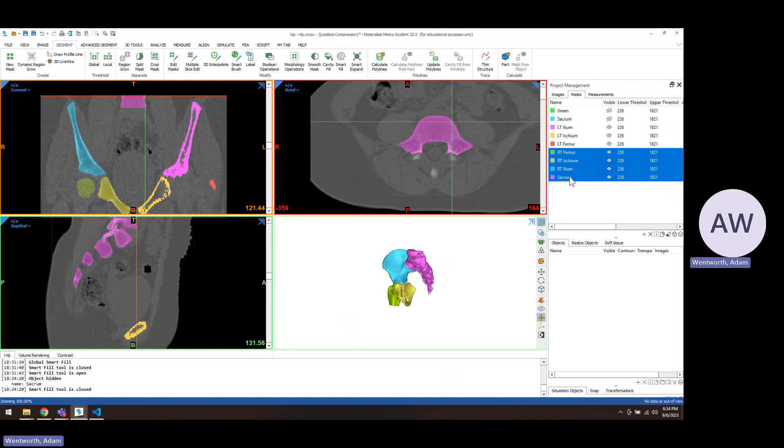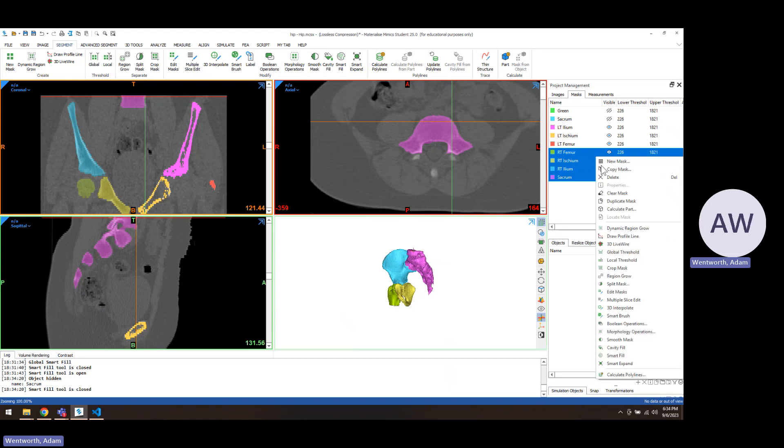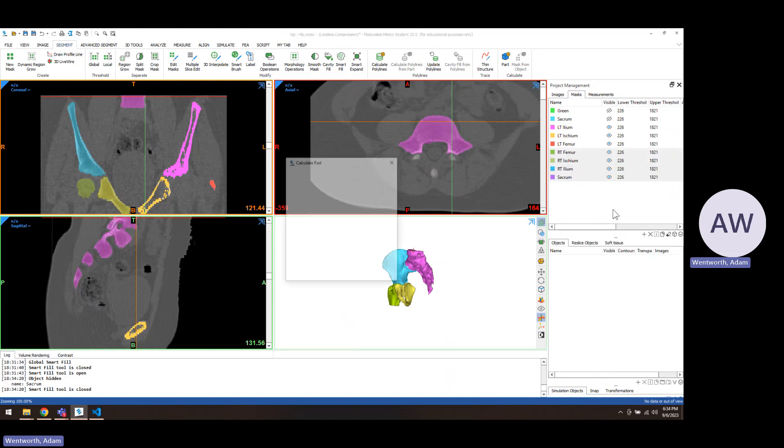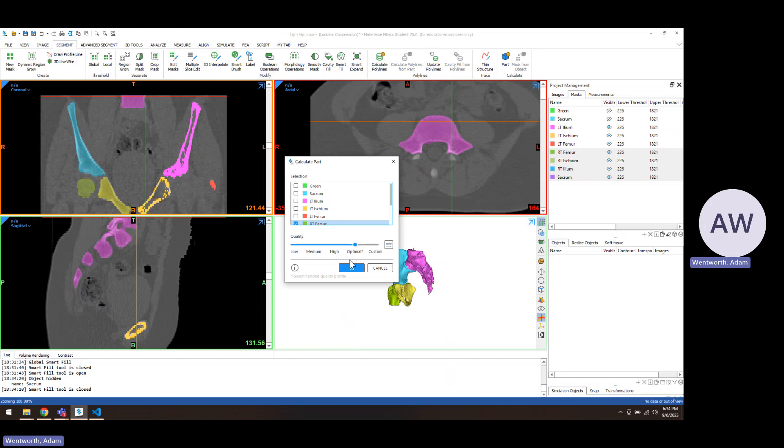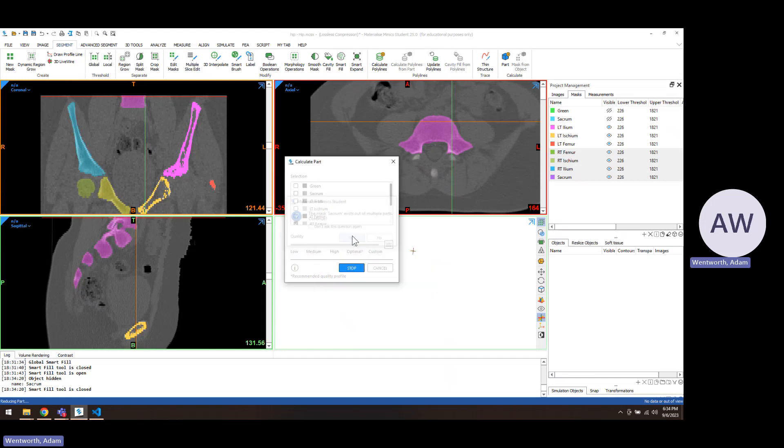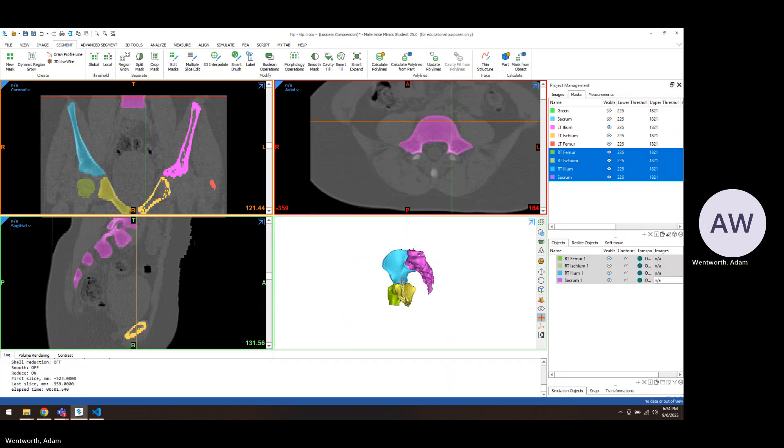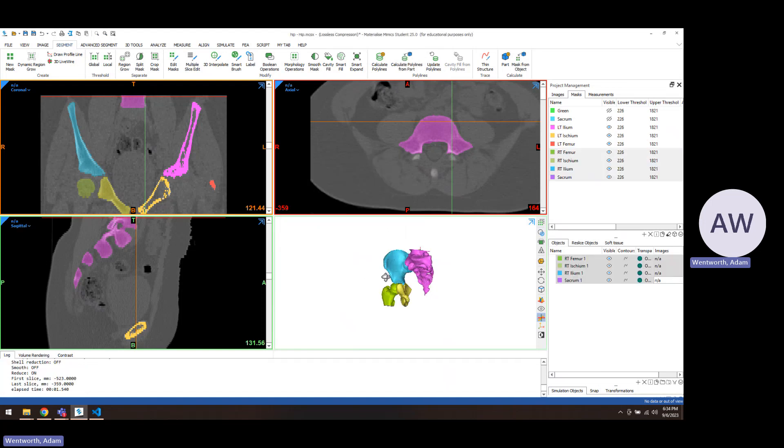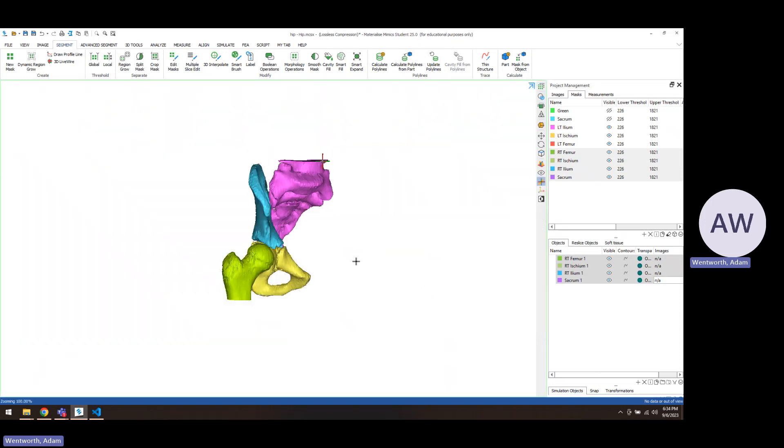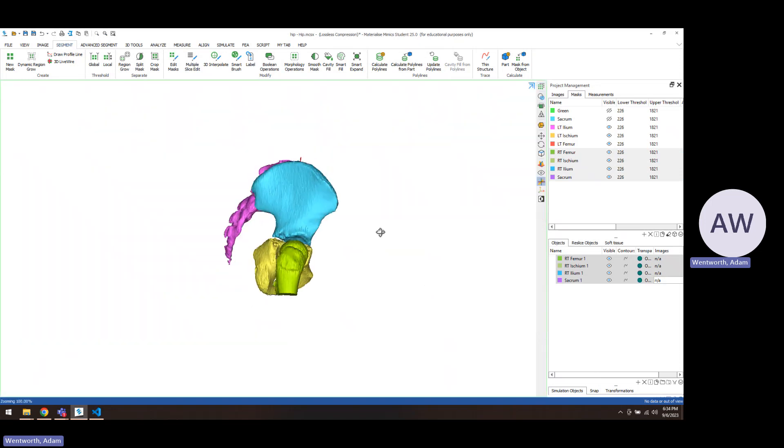After your bones are filled in, you'd select those and then you just this little box here, which calculates the parts or you can right click and do calculate part. And you can just use the optimal settings. What that'll do is it'll create what we call parts or objects. And those are defined by triangles on the surface. And they appear a little bit smoother.